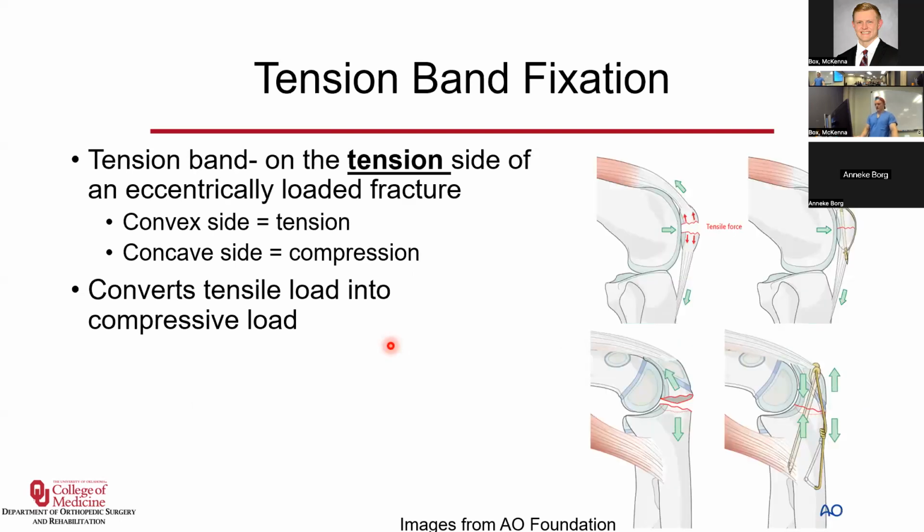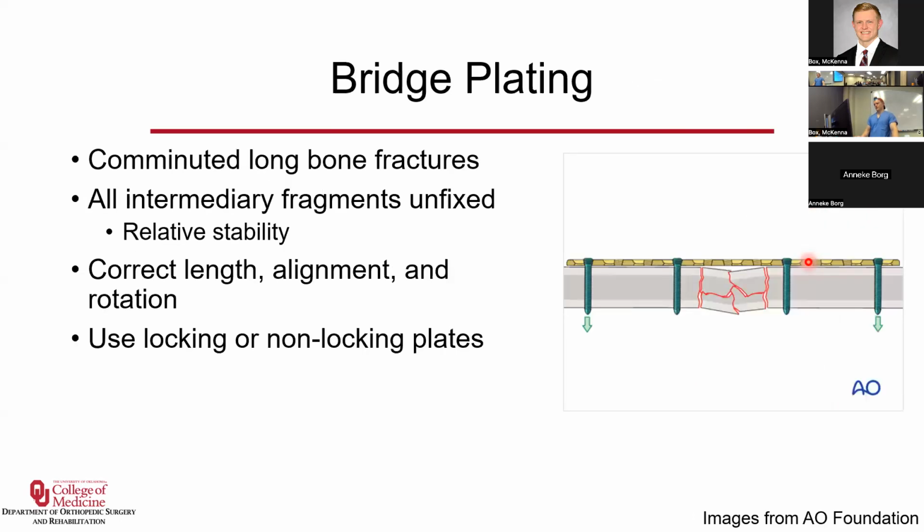You can also use this with olecranons and patellas. So it's taking a tensile force, and so placing these wires and screws will take that tensile force and turn it into a compressive force at the fracture site.